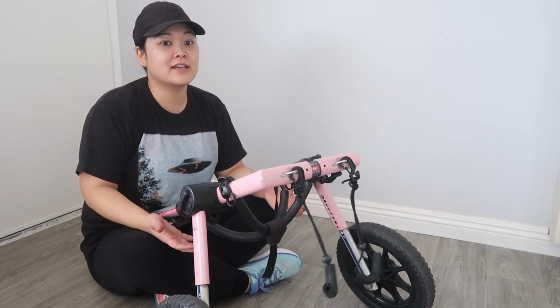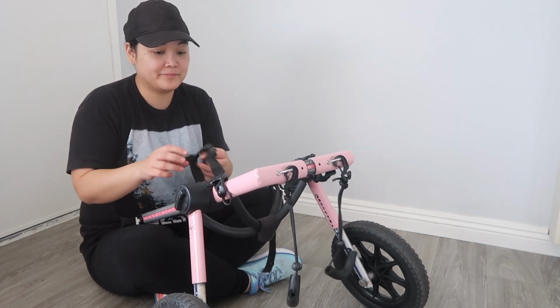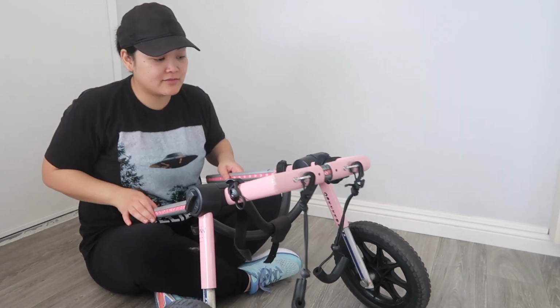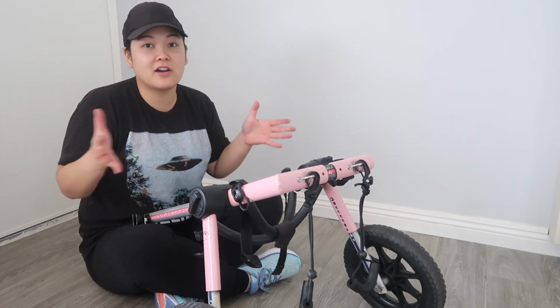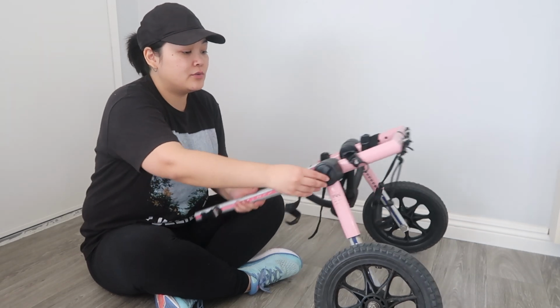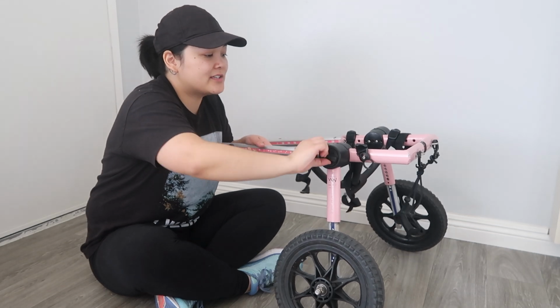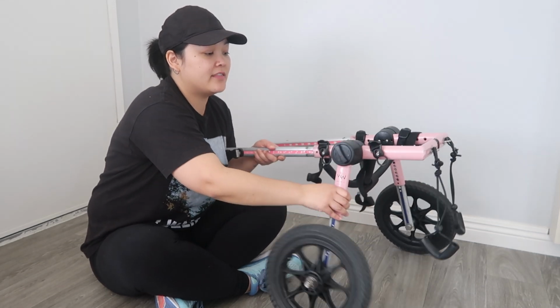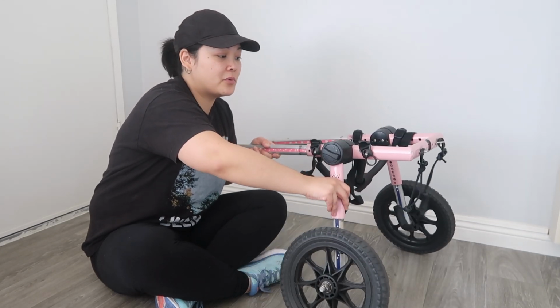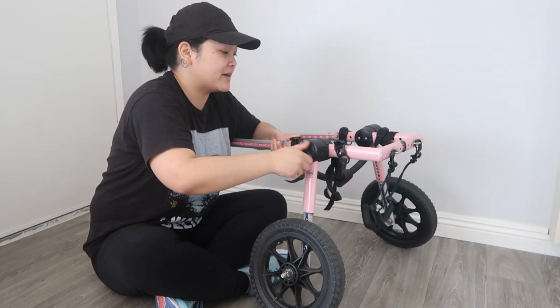And at least from what I've learned, there's no exact guidelines to, you need to have this on the third notch here for your size dog. Every dog is going to be different. So that goes with the wheels as well. When you twist this circle here, it actually will loosen the wheels, and then you can adjust, like if you want them more far back, if you want them more forward. We keep it right in the middle here. That's just always worked best for Zoey.